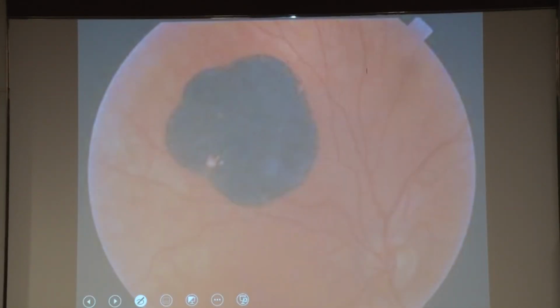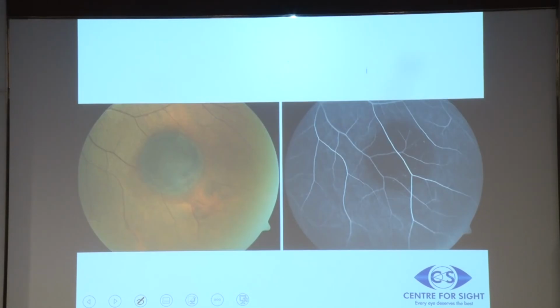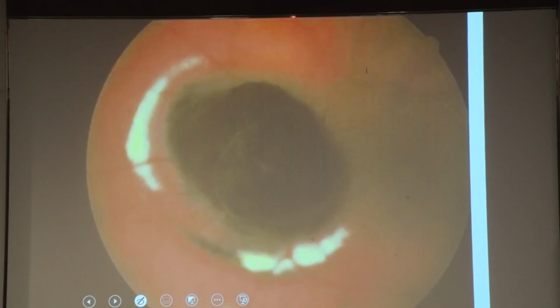This is again a black lesion, a crisply defined black lesion with lucent areas. This is congenital hypertrophy of the retinal pigment epithelium, also called CHRPE. CHRPE sometimes enlarges in size. CHRPE sometimes becomes from flat to placoid. That means it is growing into a retinal pigment epithelial adenoma. When CHRPE becomes much more nodular and develops exudation, that means it is becoming a retinal pigment epithelial adenocarcinoma.